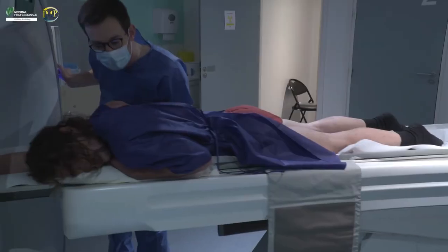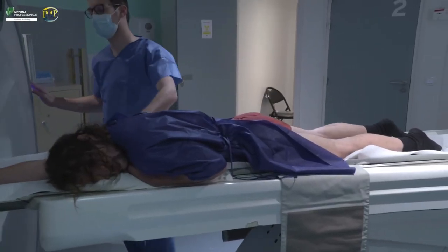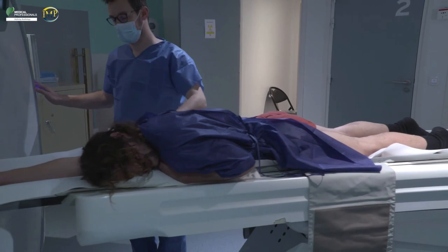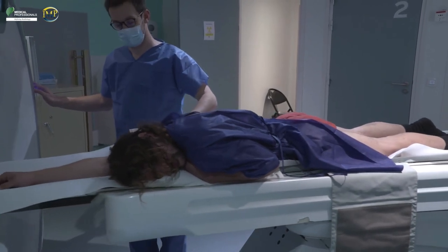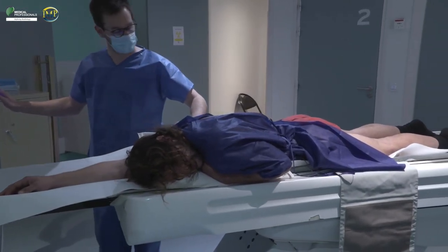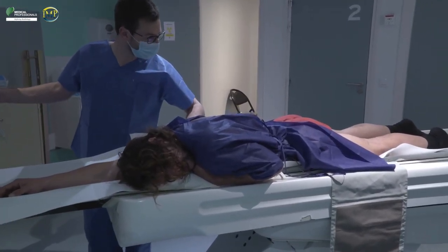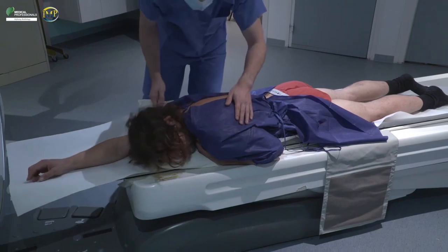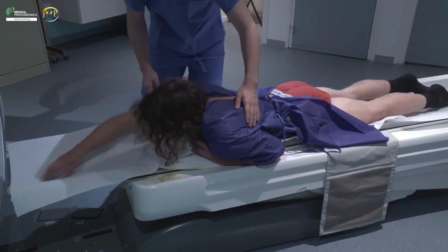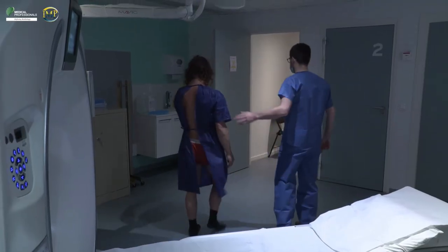After the examination, accompany the patient to the changing room and tell him or her to get dressed. Provide the patient with any post-examination instructions as indicated at your facility.